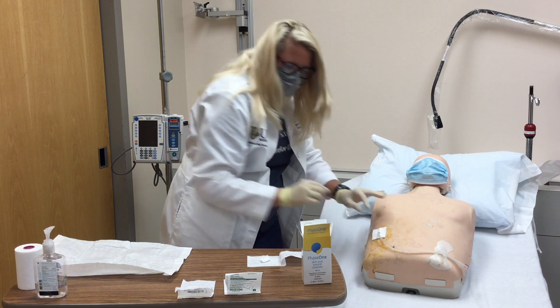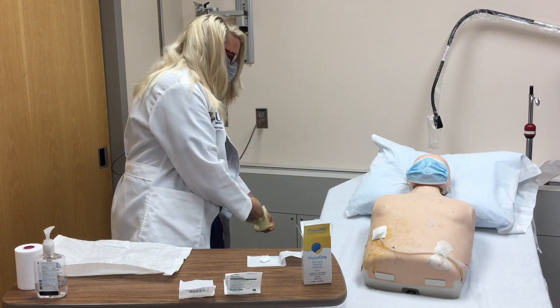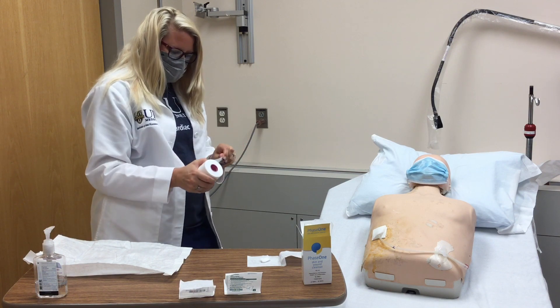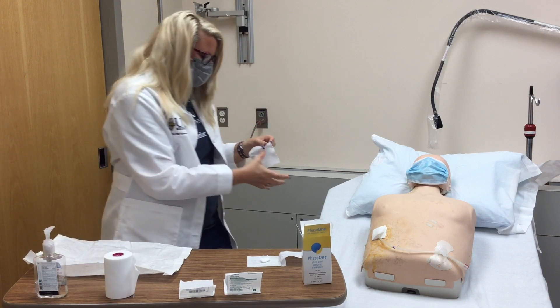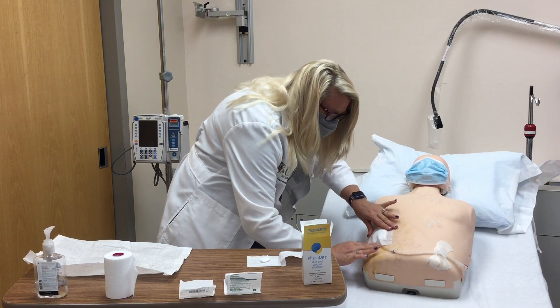Cover with the remaining gauze pad. You may now remove your sterile gloves and cover the remaining part of the dressing with Medipore tape. It's a good idea to write the date on your dressing.